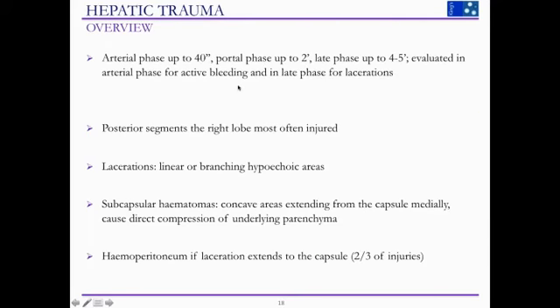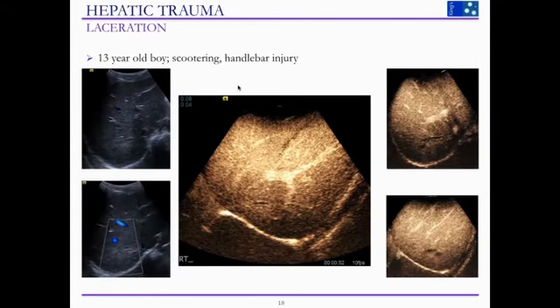Moving to hepatic trauma: you need to focus on the arterial phase initially to look for any active bleeding, and on the late phase for lacerations. More often than not, the posterior segments of the right lobe are injured. Lacerations present as linear or branching hypoechoic areas that do not enhance following contrast administration. You can also get subcapsular hematomas which may compress the underlying parenchyma. If the laceration extends to the capsule, you will also see hemoperitoneum.